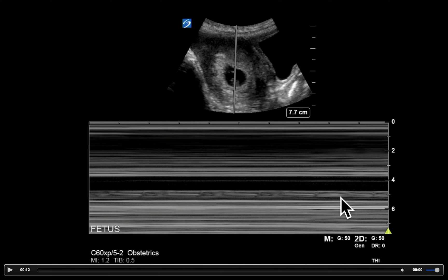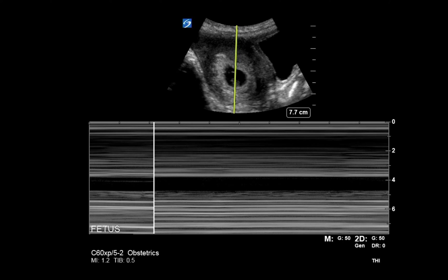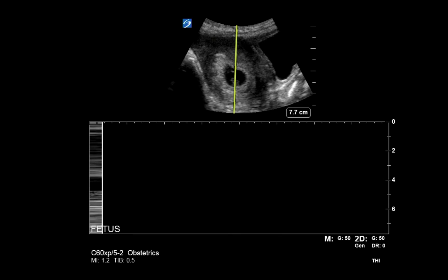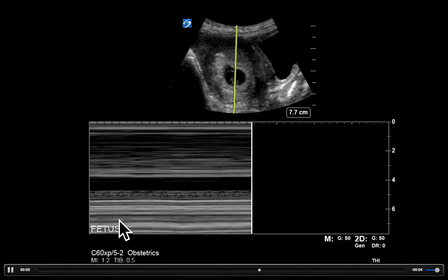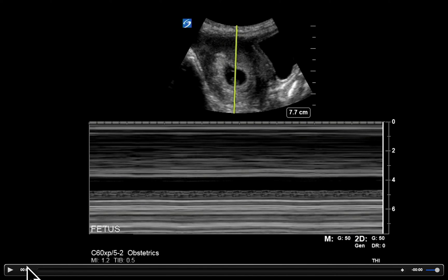I prefer to be at a slower sweep speed. This machine has three options: the first tracing was a medium sweep speed, that was a fast sweep speed and way too fast. Now we're going to see a slow sweep speed — we'll see it takes considerably longer to go across the screen. We freeze that and we can see these nice complexes; we can measure any of them just like in the original tracing to get the fetal heart rate. I prefer either a slow or medium sweep speed — fast does not work well for obtaining the fetal heart rate.